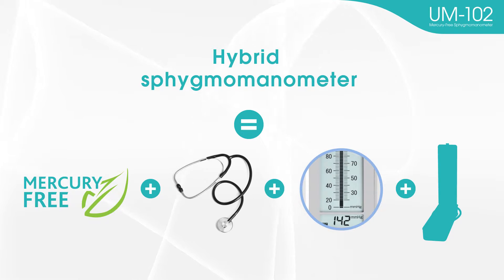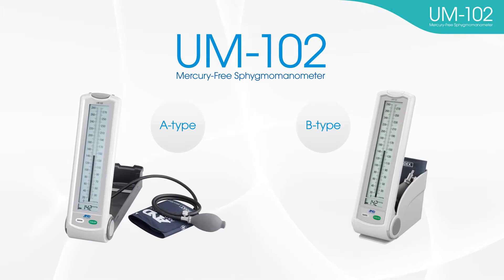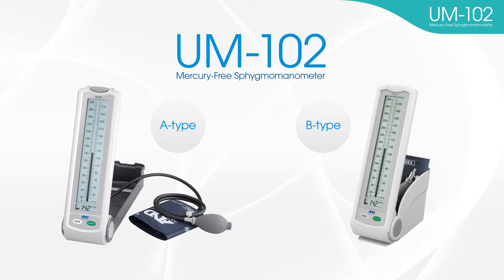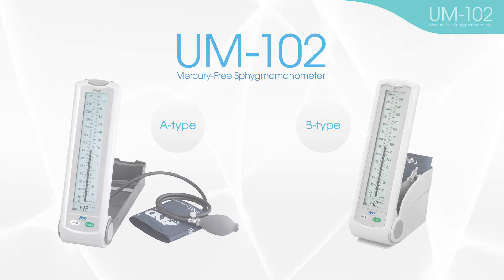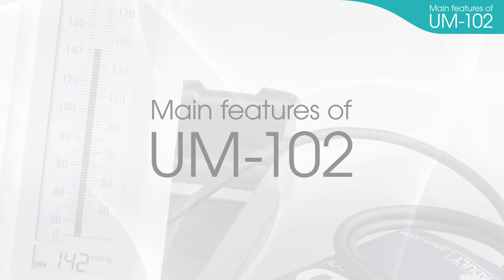The hybrid sphygmomanometer UM-102 can be used in a similar way to mercury blood pressure monitors. Therefore, they are easy to use for those who already use mercury blood pressure monitors regularly.